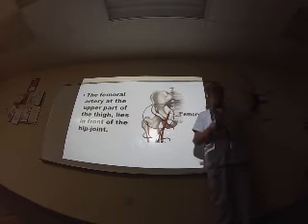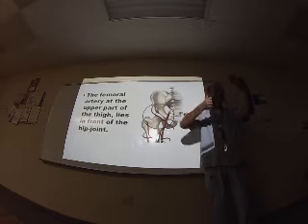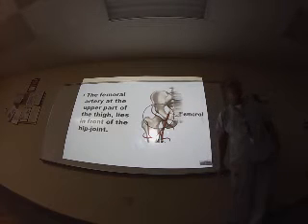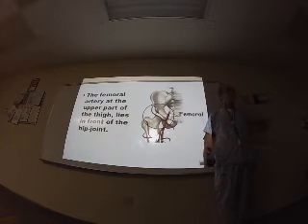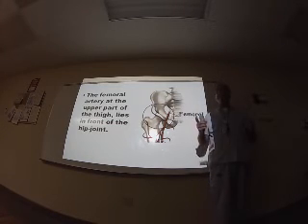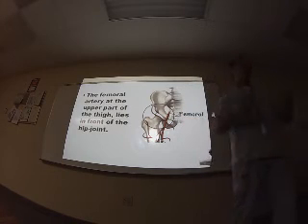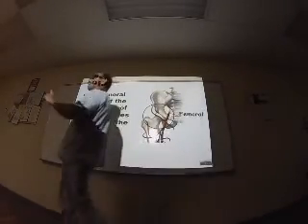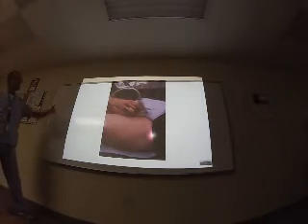With ultrasound, the doctor puts the ultrasound, and with an injection of a substance, they put the ultrasound and put the injection inside and close the cavity. It's a very interesting procedure of ultrasound. It's therapeutic, not diagnostic. Remember, therapeutic is when you know and you are going to repair. And diagnostic is only when you want to see. This is a very common complication of catheterization. You can see here.